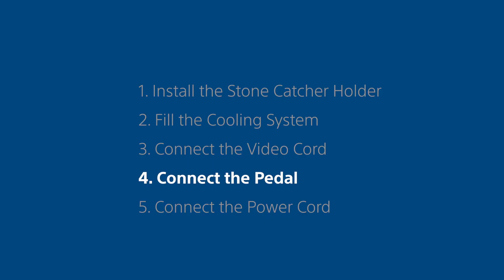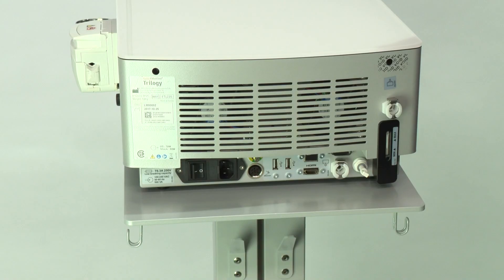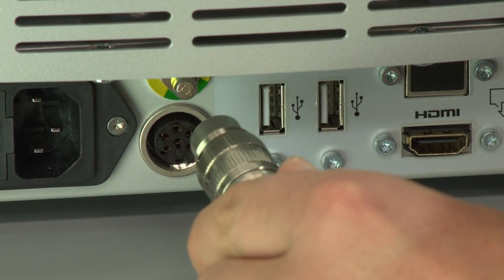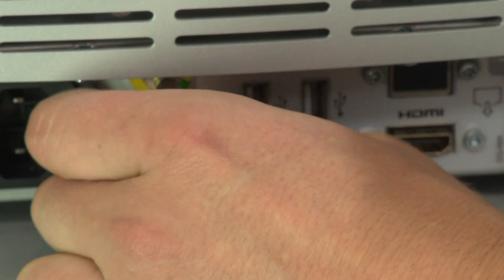Step 4. Connect the pedal. Connect the pedal cord to the corresponding connector at the rear of the unit. Pay attention to the pedal cord connector orientation. Turn the nut clockwise to secure.